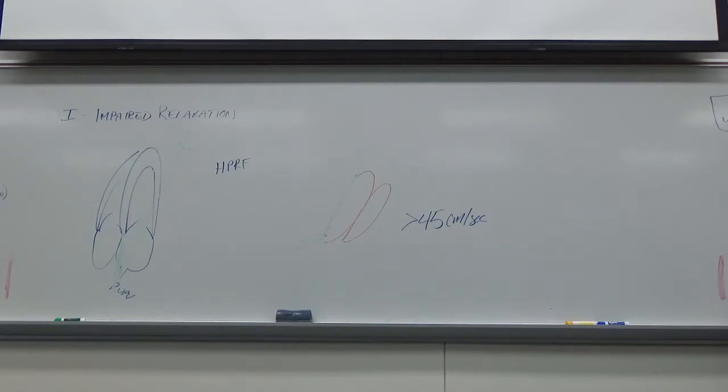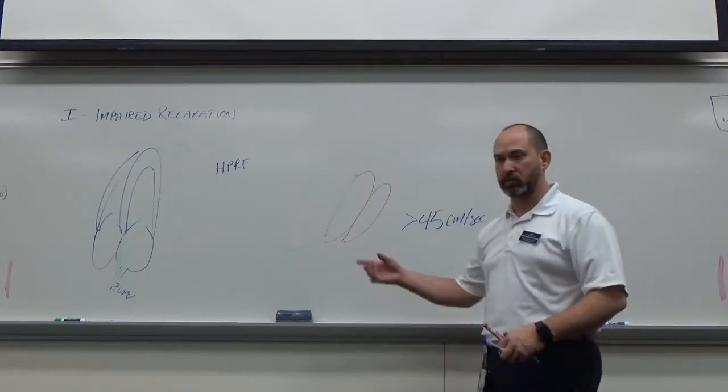We forgot to talk about the velocity of the mitral E wave. So on grade 1, or impaired relaxation, we're talking less than 8 centimeters per second velocity on tissue Doppler, on the E prime. Okay, normal is anything greater than 8. Now it's anything less than 8. Okay, so 8 for tissue Doppler is the same number across all of these. It's either greater than or less than that. Okay? And I'll give you a hint: beyond this, they're all less than 8. Okay? So impaired relaxation, tissue Doppler, we go less than 8.